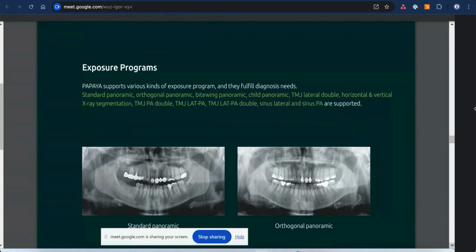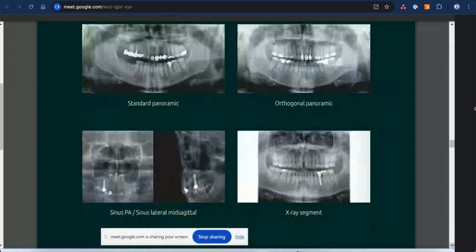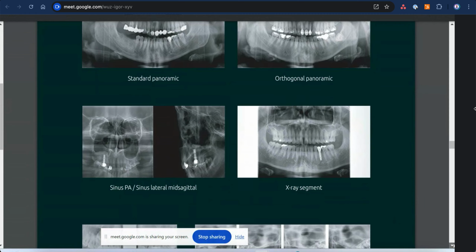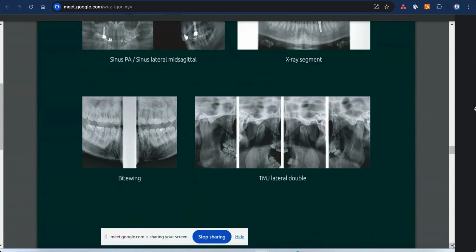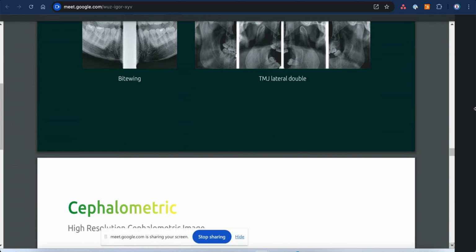Exposure programs, what do they do? Here is the standard orthogonal. We have also the sinus and the sinus lateral. We have also the X-ray segment. This is the bite wing and the TMJ lateral double. This is the cephalometric now.